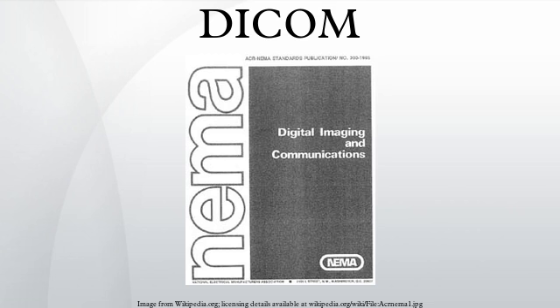The DICOMDIR information provides substantially greater information about each file than any file name could, so there is less need for meaningful file names. DICOM files typically have a DCM file extension if they are not part of a DICOM media. The MIME type for DICOM files is defined by RFC 3240 as application/dicom. The uniform type identifier type for DICOM files is org.nema.dicom. There is also an ongoing media exchange test and connectathon process for CD media and network operation that is organized by the IHE organization. MicroDicom is free Windows software for reading DICOM data.